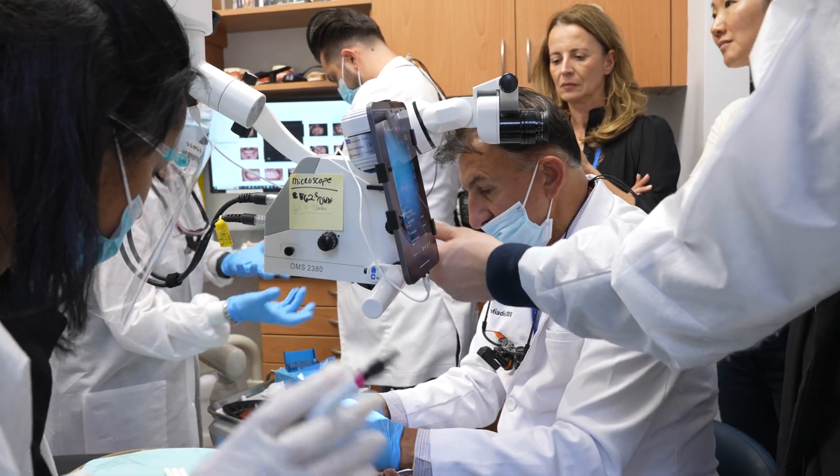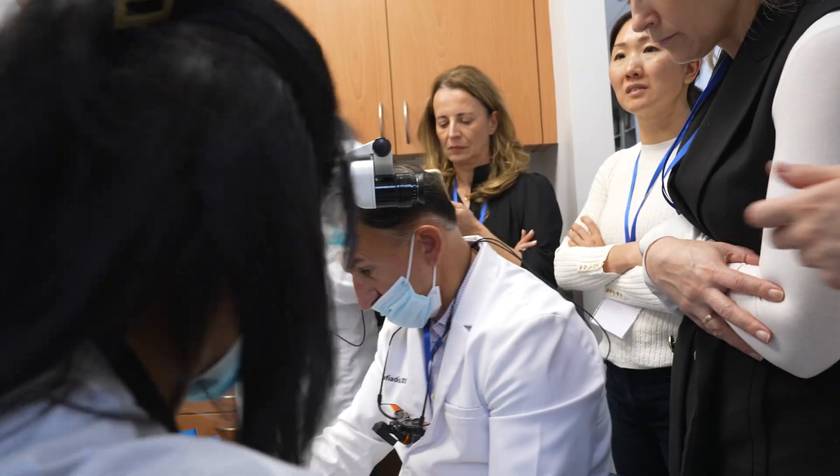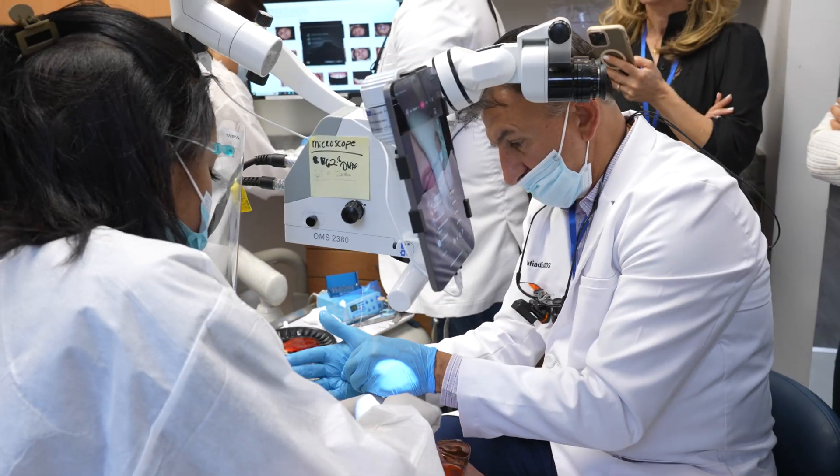Be careful on transfer. Put it on my glove. If anybody drops the tooth, they must be thrown out of the window — not drop the tooth. Very strict at New York Smile Institute.